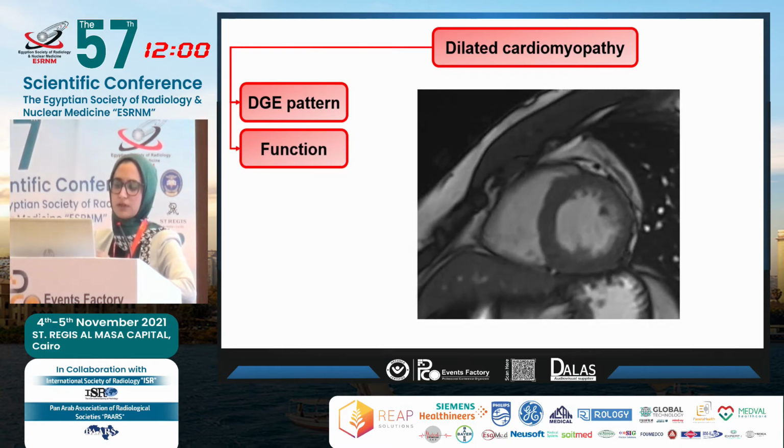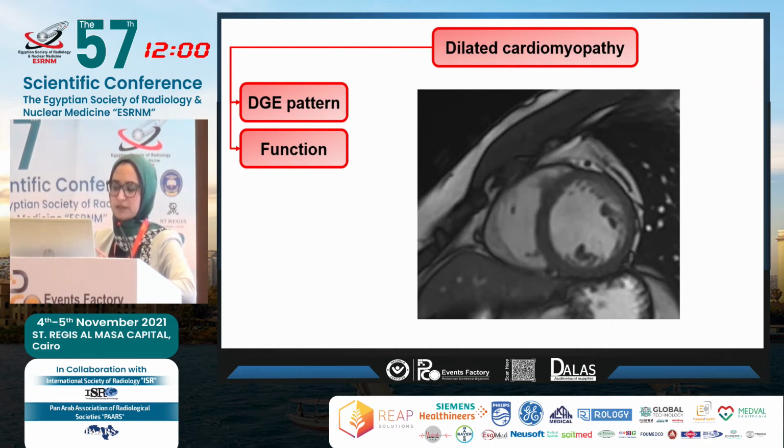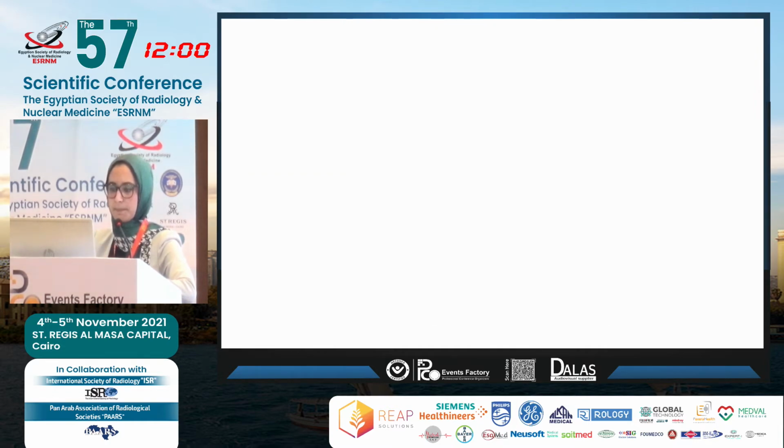You need to answer the function question, and this is easily provided by the cine images.